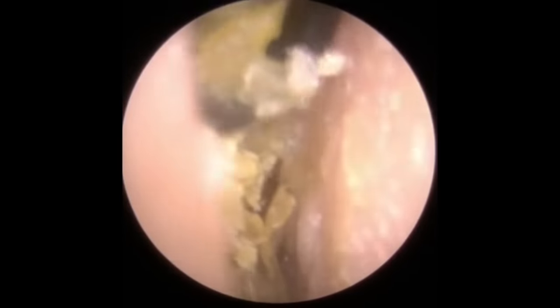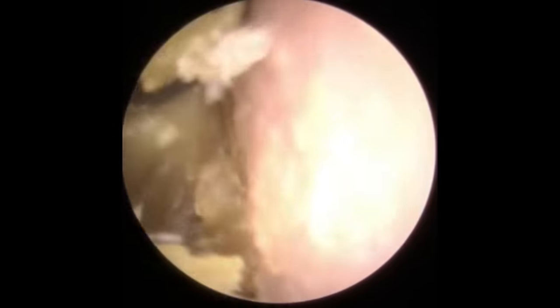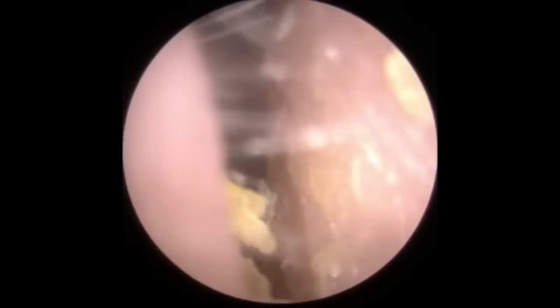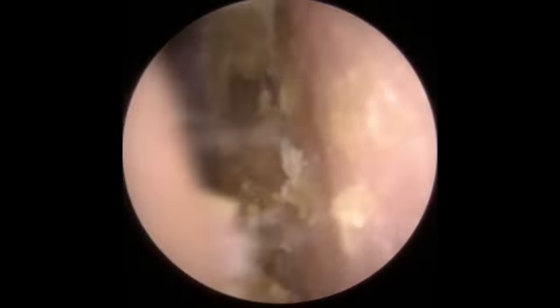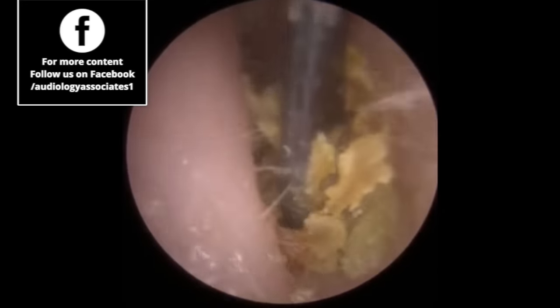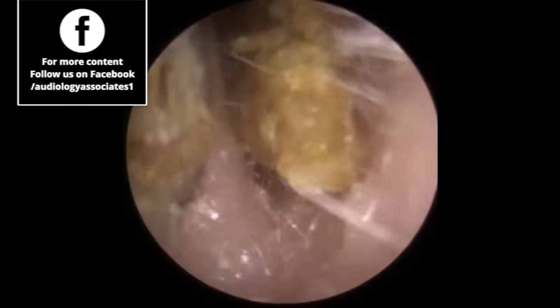What's complicating things a little bit is the entrance to the canal is so narrow. As we get older, sometimes our ear canal will go from that nice rounded shape to a much more narrow, very thin oval shape. We're having a little bit of difficulty getting the ear canal to accommodate the Jobson horn at the moment. We're using the Jobson over the Zolnir tube just because the wax is so tough and hardened up — using the Zolnir tube to try and remove the wax is going to be difficult. It's not going to get a grip and it's just going to keep brushing against the outer edge. So we're going to use the Jobson horn to break the wax down and then tidy up the looser sections with the Zolnir tube later on.